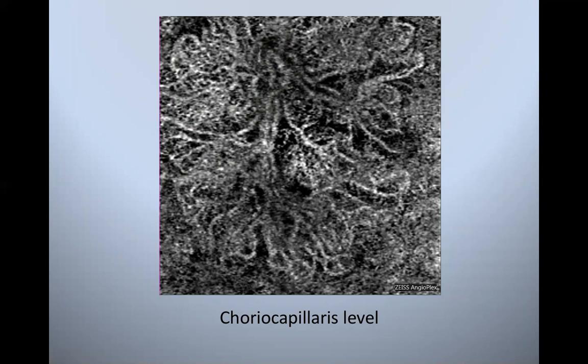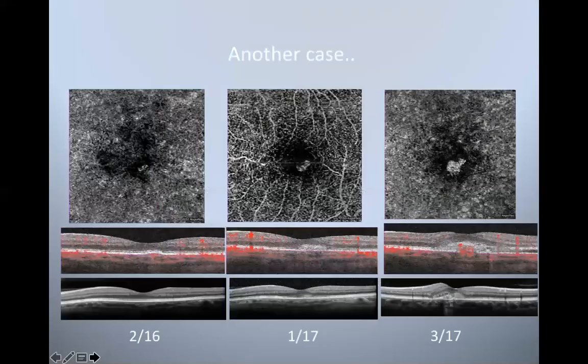So one of the thoughts is, I published a paper in the Journal of Ophthalmic Photographers Society on this particular entity, and Phil Rosenfeld did a very big study on this. And one of the thoughts is that these vascular cellular junctions in the vascular walls are more tightly compacted than in typical neovascular complexes. So they're not leaking out any of that fluid, or if they are, it's leaking very slowly, and you're not able to really appreciate that neovascular complex on anything but OCT angiography.